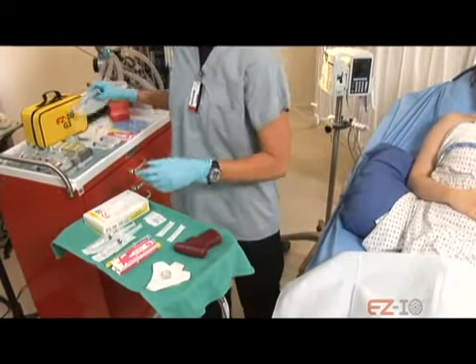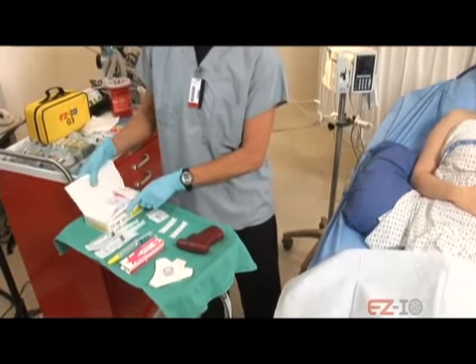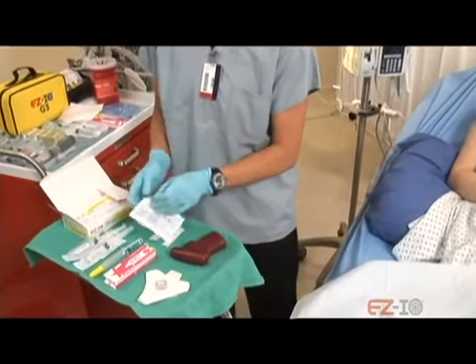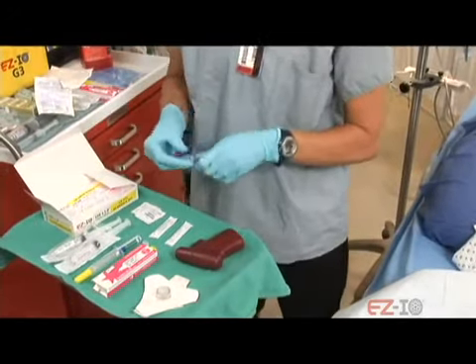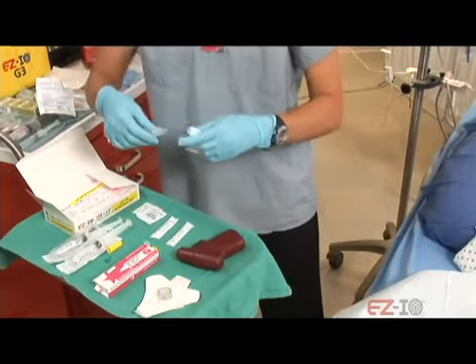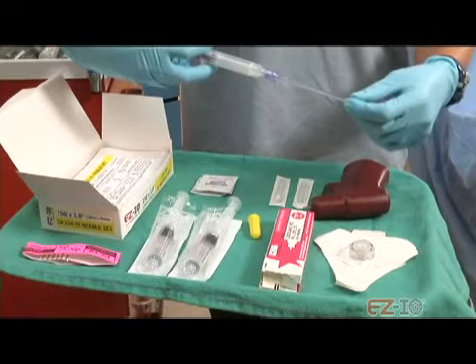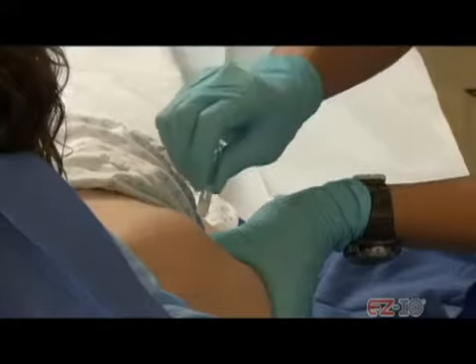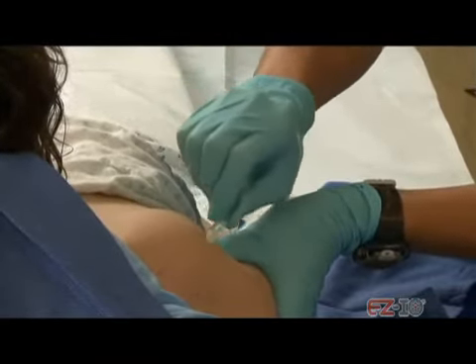When you're ready to place the needle, remove the EZ IO driver from the case and remove the trigger guard if present. Select the appropriate needle set and inspect the packaging for damage. Prepare the EZ Connect tubing that comes with the needle set. If the patient is responsive to pain, consider 2% lidocaine without preservatives or epinephrine, also known as cardiac lidocaine, for anesthesia prior to your initial saline flush. Once your EZ Connect is primed, clean the insertion site according to your institutional policy for aseptic procedures.